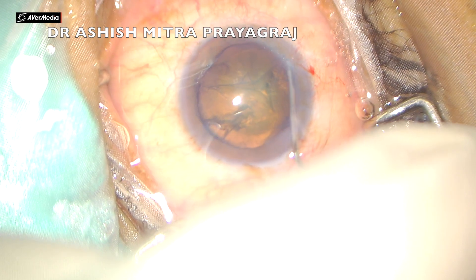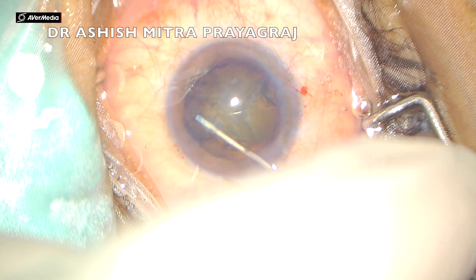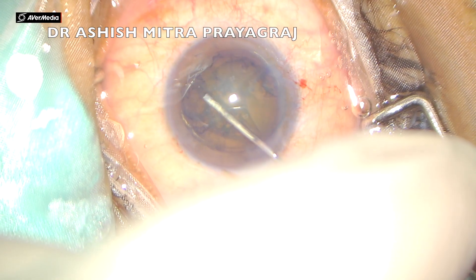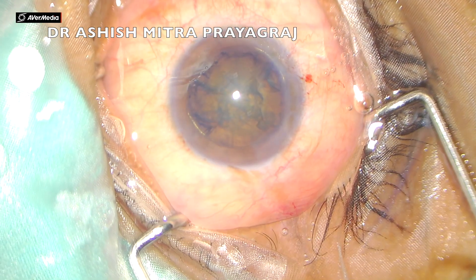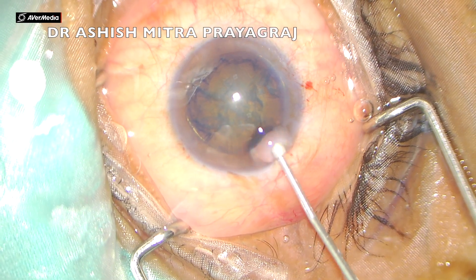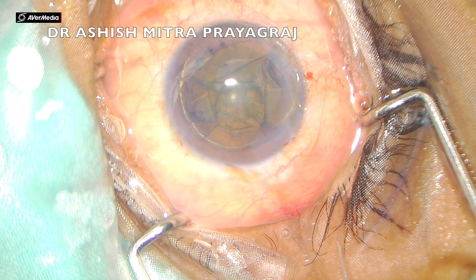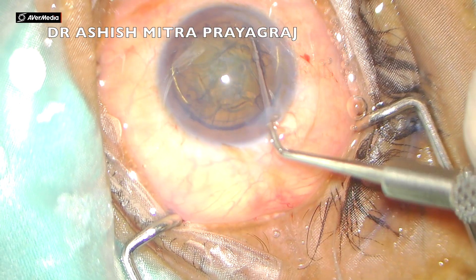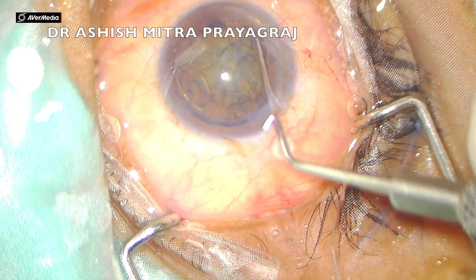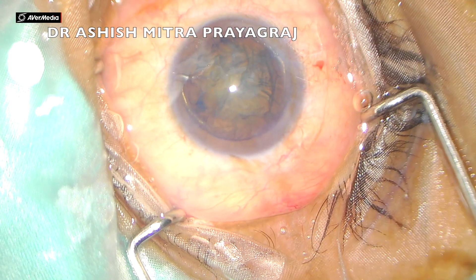I will explain what happens with just one crack and a fairly good-sized rhexis. After doing hydrodissection I am tapping so that there is no fluid entrapped, as I do in many of my cases. You can watch the golden ring being seen beautifully, and after a good hydro one can see good rotation after tapping.